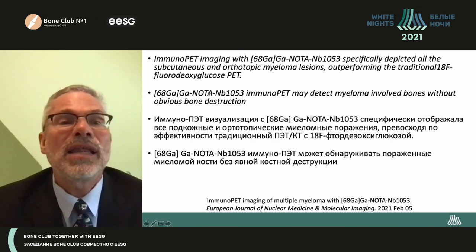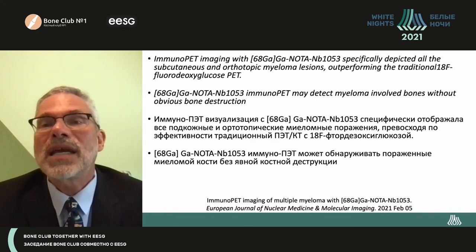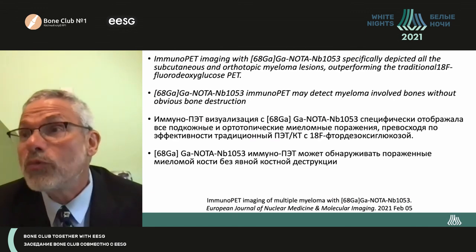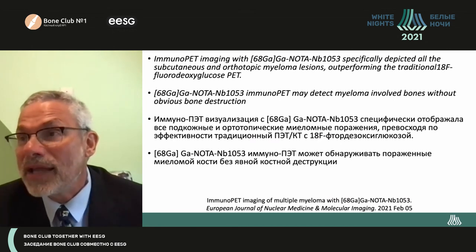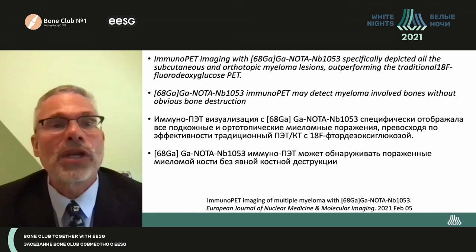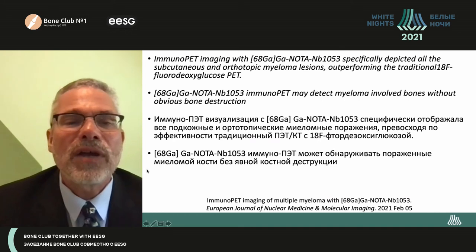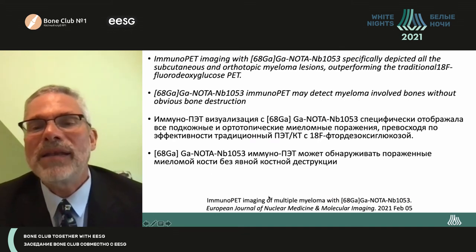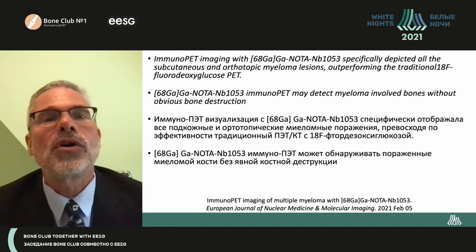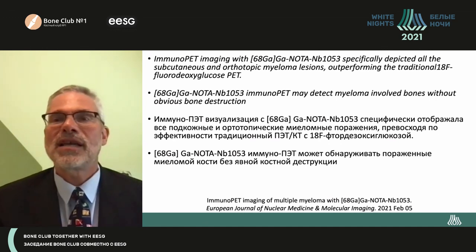They noted that their gallium-68 CD38 probe may detect myeloma-involved bones without obvious bone destruction, which is what we really want, because we want to detect myeloma at its early stages and we want to detect recurrences at their early stages. And so I put forward to you that we may have a future in other PET markers for myeloma other than fluorodeoxyglucose. And I thank you very much for this invitation.